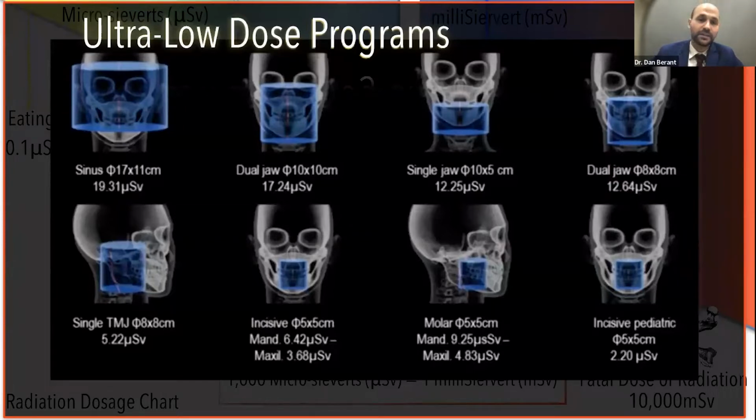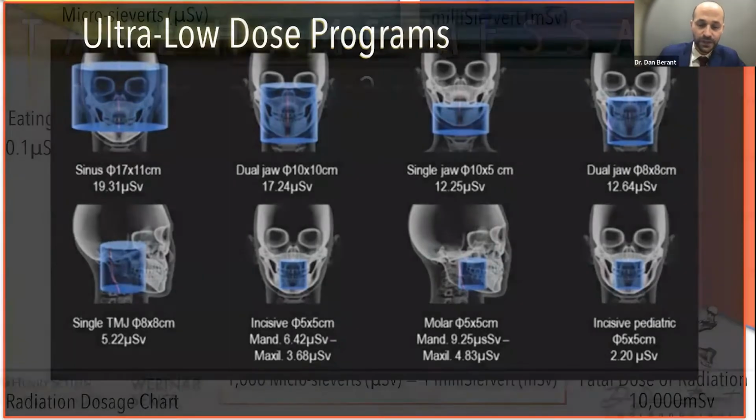Now, this is a conversation that I want you to have with your CBCT rep, making sure that you're not irradiating unnecessarily. The nice thing too is the fact that a CBCT doesn't have overlap. So if we think about a full mouth series, taking multiple PAs or bite wings, there is some overlap and excessive information that we're gaining while still irradiating the patient. The nice thing about a CBCT is that it's only a single section and you get all that information with no overlap.